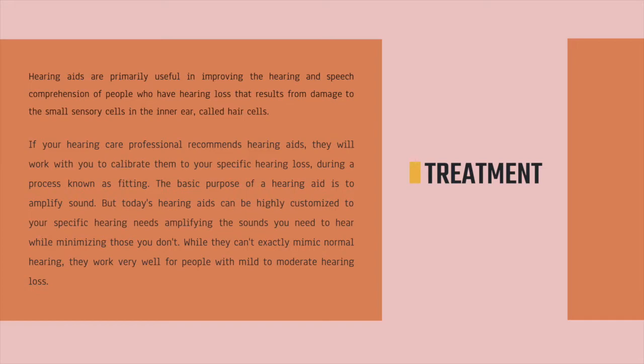This device increases the sound vibrations that enter the ear. The hair cells that survive detect the larger vibrations and convert them into nerve signals that are passed on to the brain. The greater the damage to a person's hair cells, the more severe the hearing loss, and also the greater the amplification of the hearing aid needed to make the difference. However, there are practical limits on the amount of amplification this aid can provide. In addition, if the inner ear is too damaged, then even the large vibrations will not be converted into nerve signals. In this situation, this device will be ineffective.